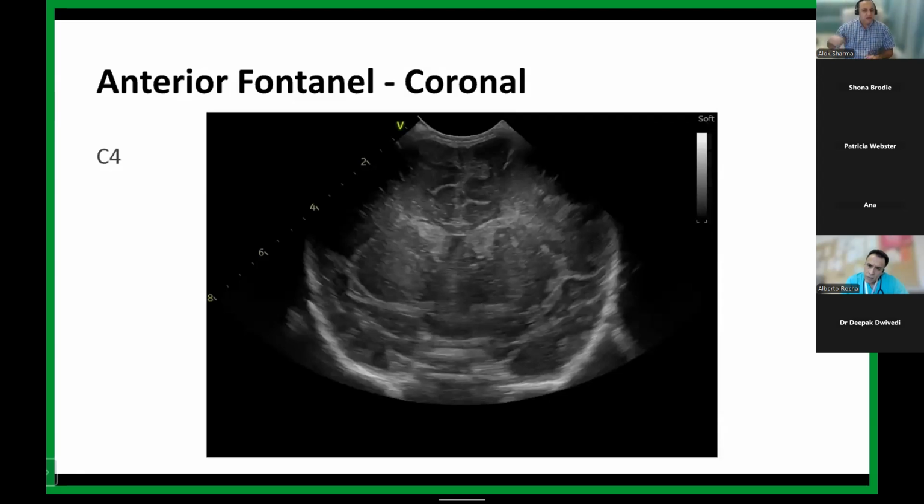So this baby obviously had perinatal compromise with an in utero bleed. Like I said, if you develop very early cystic change, these could be antenatal bleeds. And almost certainly, no doubt, this would be a baby who would fit my criteria for doing an MRI. Yes, of course. It would be very interesting. If I know, I will inform you. It's a beautiful case.